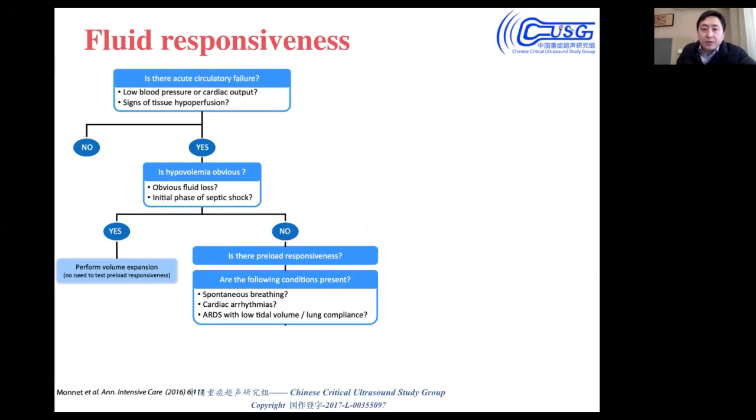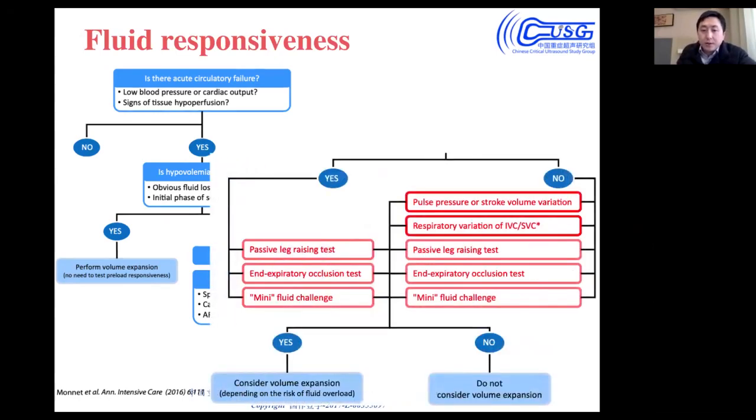Fluid responsiveness is always a key topic when we talk about increasing the cardiac output. We use many tools and many measures to assess the fluid responsiveness.